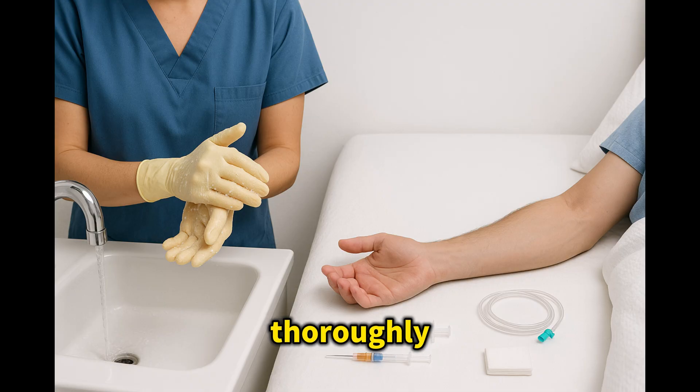First, wash hands thoroughly, then don gloves without touching the outer surface. Clear the workspace and arrange tools within reach. This preplanning ensures your procedure flows smoothly and safely.